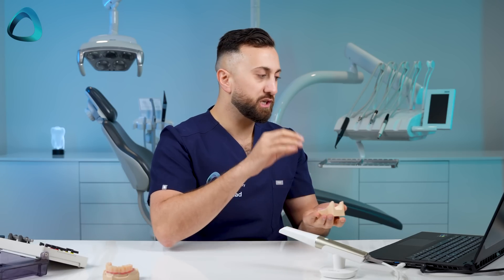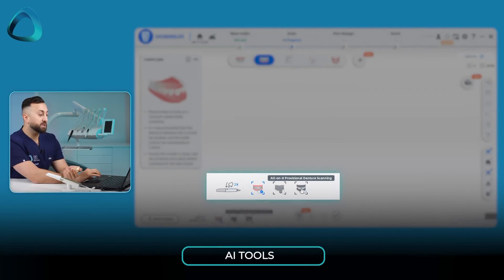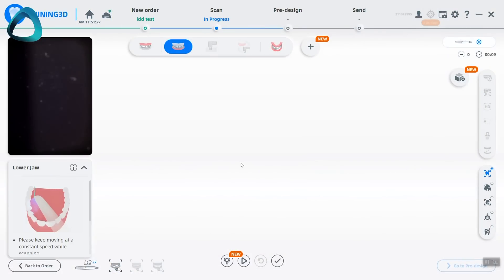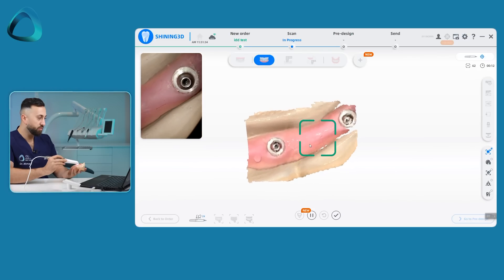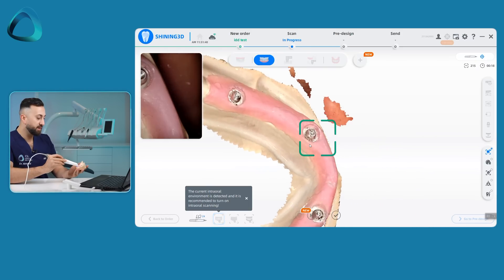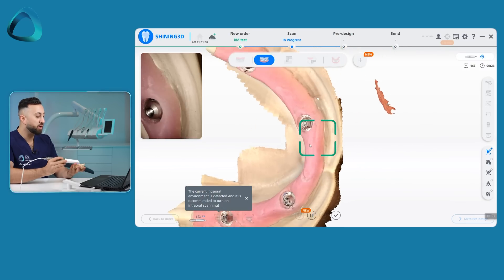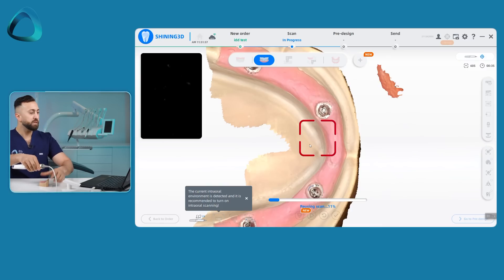First it tells you to scan the edentulous arch. On the bottom left you've got a whole bunch of AI tools: intraoral, edentulous, All-on-X, provisional denture scanning. These AI tools are critical — if you try to scan a model while it says intraoral, you're going to have a really hard time. I'm going to turn on intraoral and start scanning right at the back at the top of the implants, then move forward and take the scan. The Shining Elite is a capable scanner — it's really what we've come to expect nowadays in the intraoral scanner market.